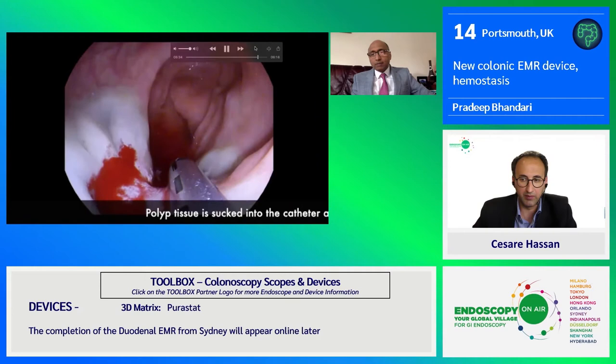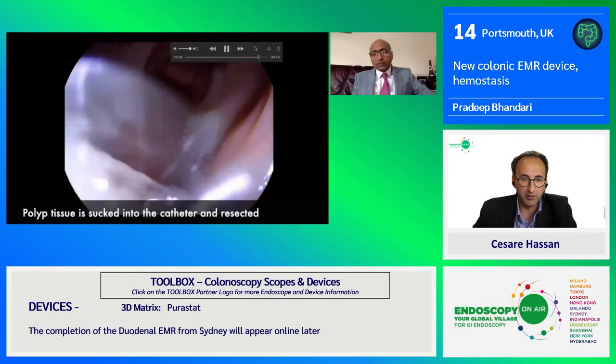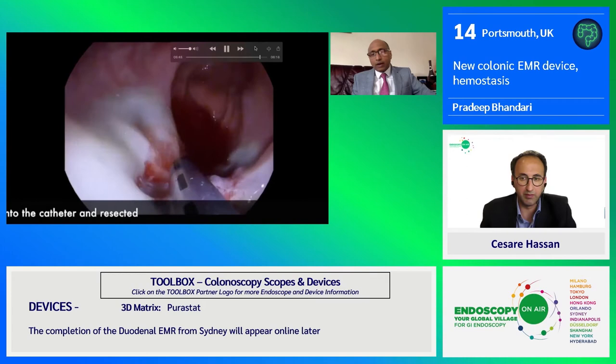You see a little bit of oozing — that's normal, and you should never worry about that. You can suck the fluid pool and any residual scar or adenoma that you're worried about.